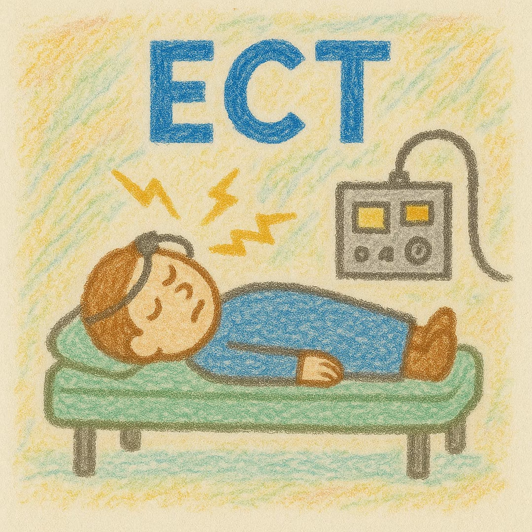So with seizure thresholding, at that very first ECT, we're going to set the machine at its lowest dose basically and stimulate and then see if we get a seizure. And if we don't, we're going to increase the dose. And usually there are some tables that help you decide how far up to go. But you could just try doubling the dose, for example.